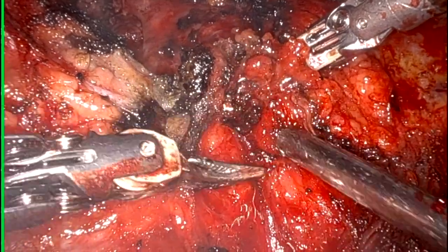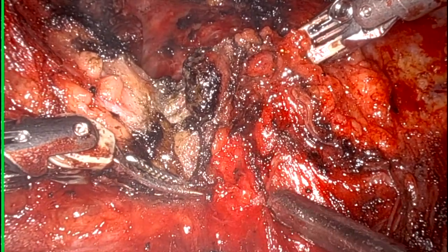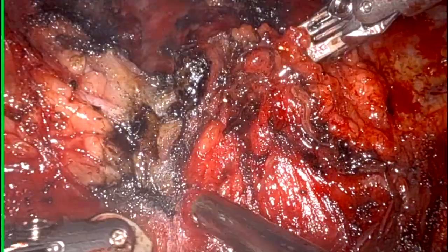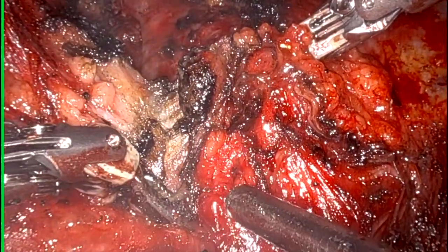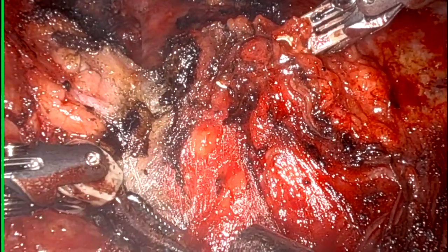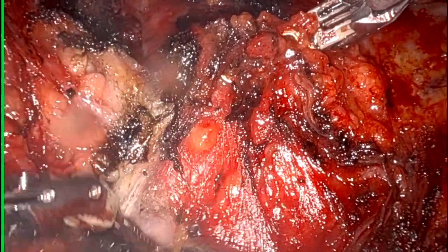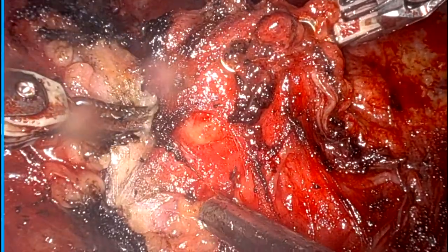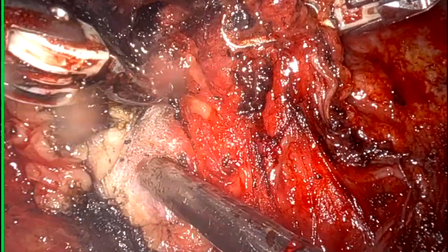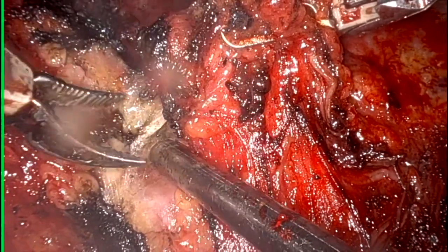I have already told you that in this case we are using two arms and a camera. The two arms are the Maryland bipolar and fenestrated bipolar. The camera is 30 degree. Don't confuse this with 0 degree, this view is from a 30 degree camera and I always prefer 30 degree. And my assistant is holding this suction. So the idea is to take the tissue up from the sternocleidomastoid muscle as we do in open surgery.